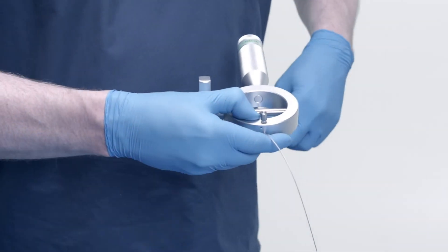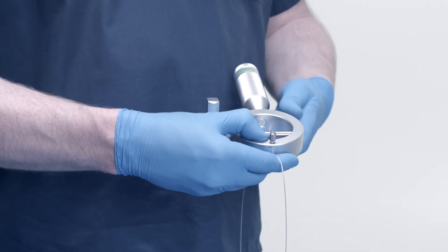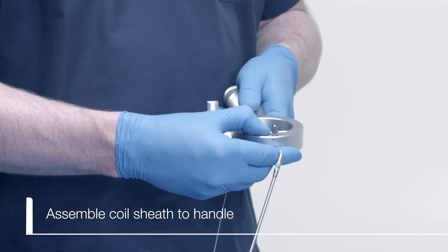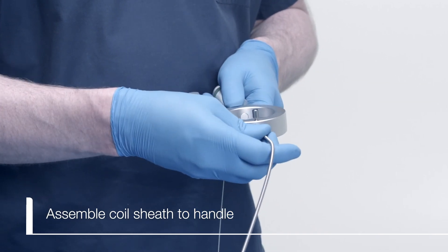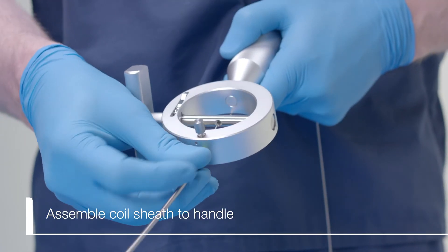Insert the green proximal end of the coil sheath into the hole at the top of the emergency Lithotripsy handle. Lock the sheath in place by turning the thumb screw clockwise as shown.